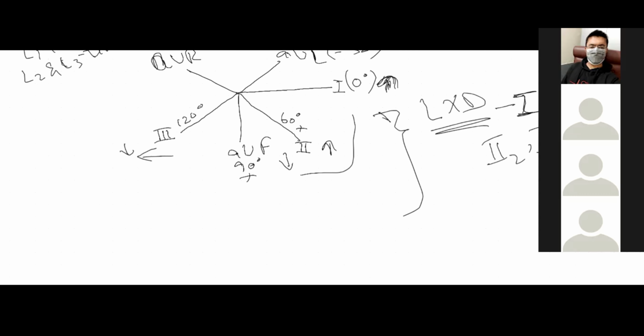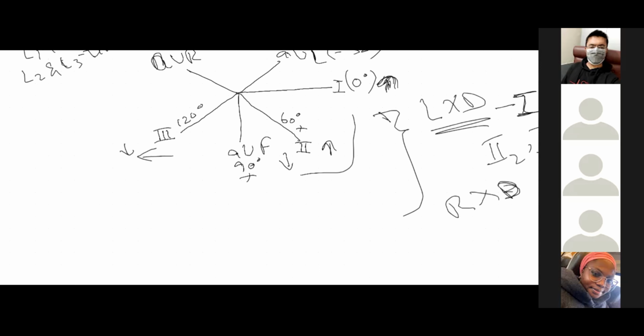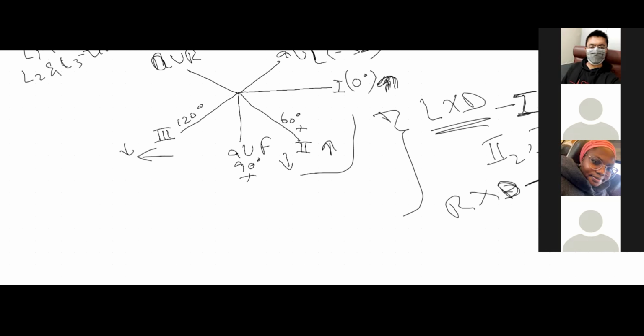In right axis deviation, lead 1 becomes negative, and the inferior leads, that is lead 3 and AVF, will become positive.